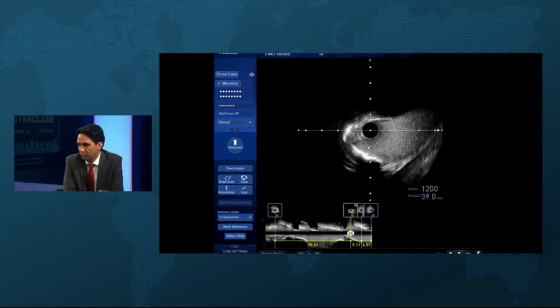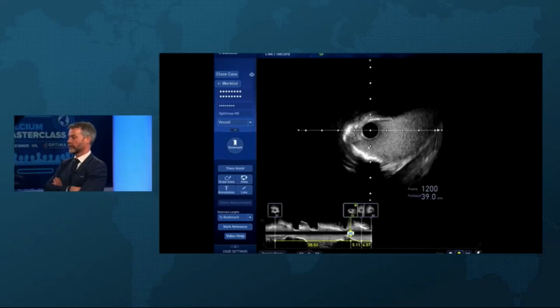If you have to pot the proximal left main stent, you have to come proximal to it. It's very difficult not to come proximal to it. You really do. So you just go low pressure. 48? Yeah. I go 38 and have a 6 overlay, just more overlap.